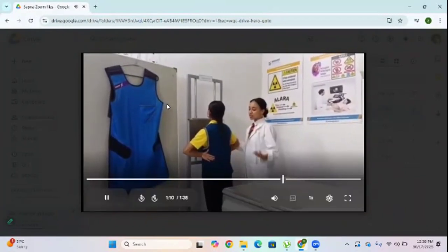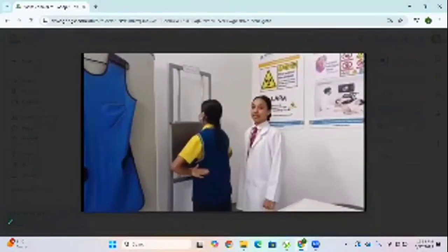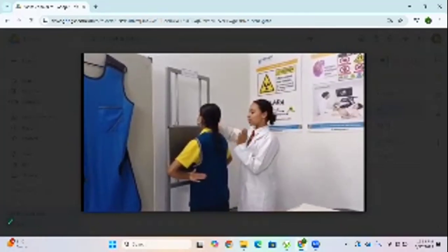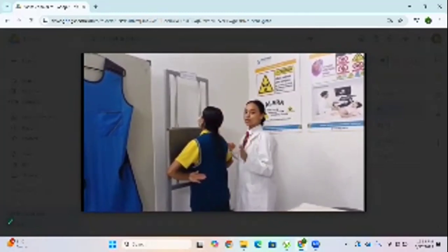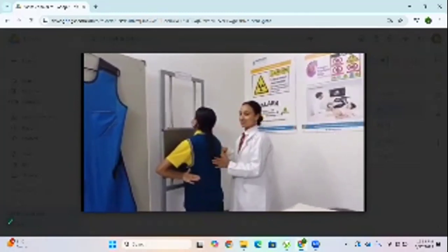In this, the X-rays are going to pass from the back to the frontal portion. We also need to make sure that the patient's chin is not in contact with the cassette. The chin should be slightly tilted upward so that we could get a clearer image and the thoracic portion is covered.